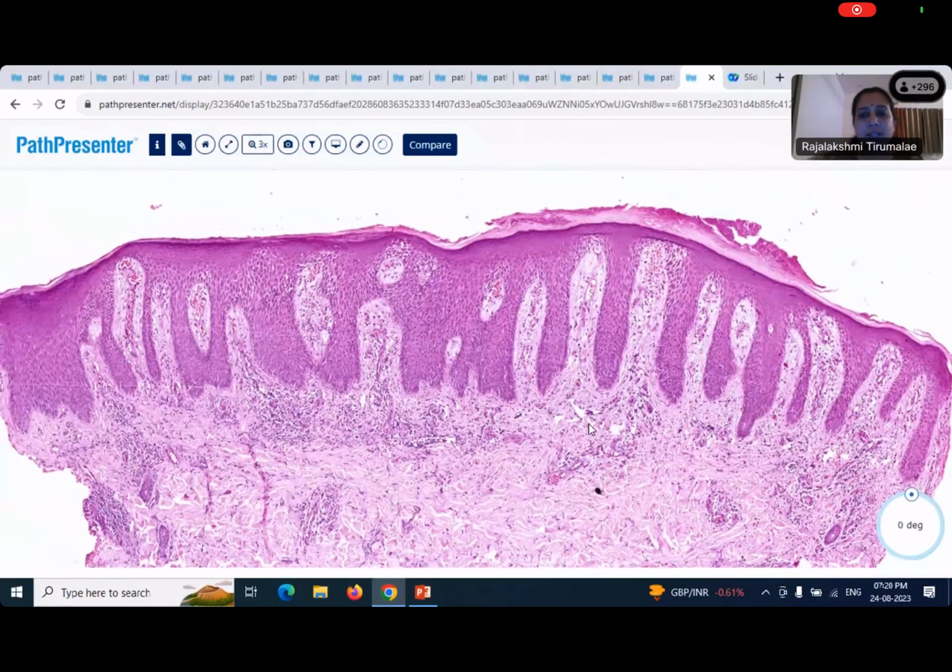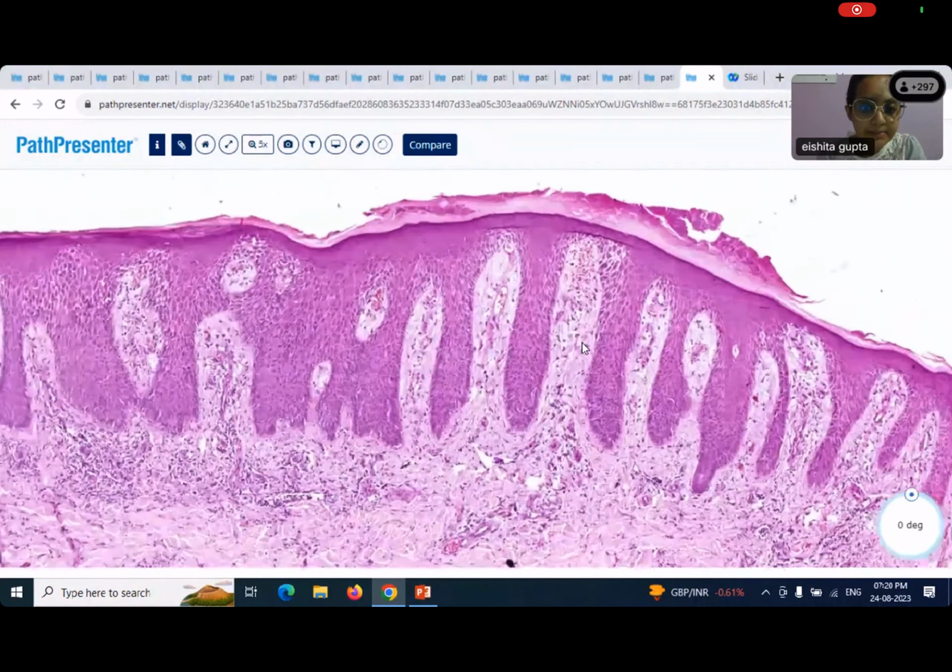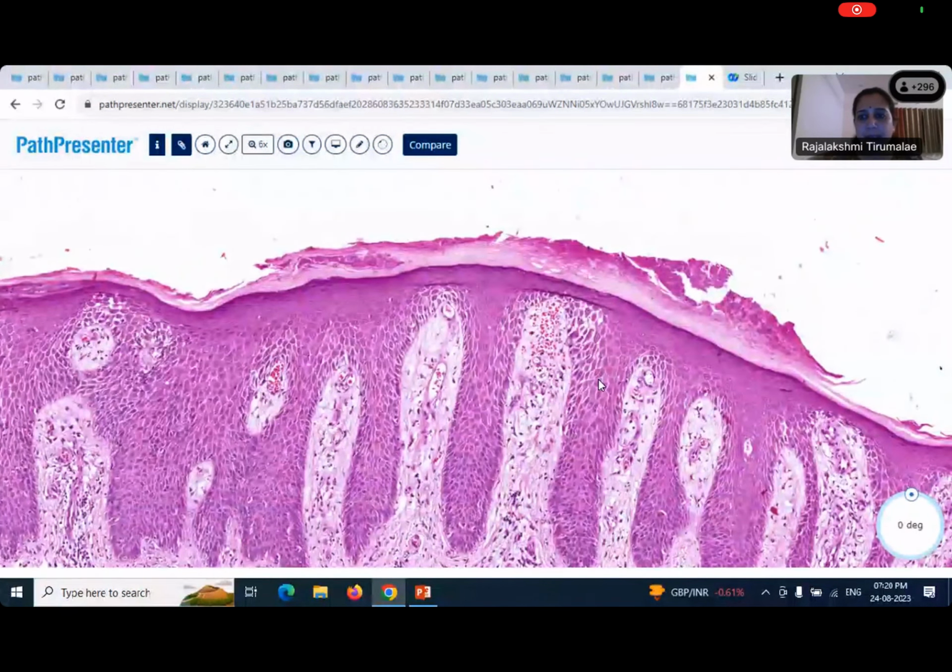You can call this even regular psoriasiform acanthosis, right? Yes. Right. Okay. Then you described all the findings. So now, after having described the pattern, can we look at what's happening in the stratum corneum? Are there some clues here?